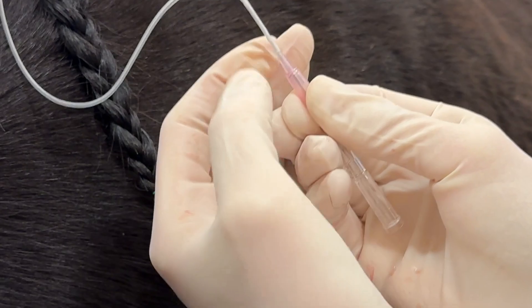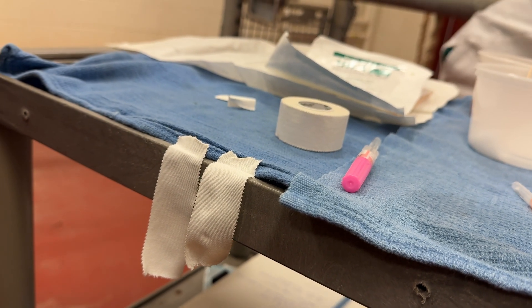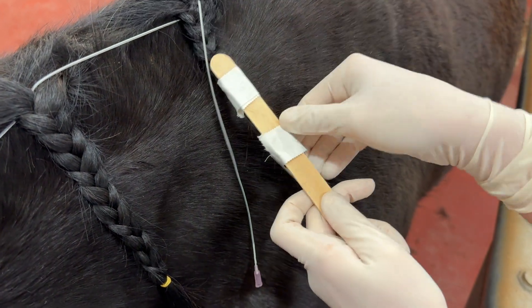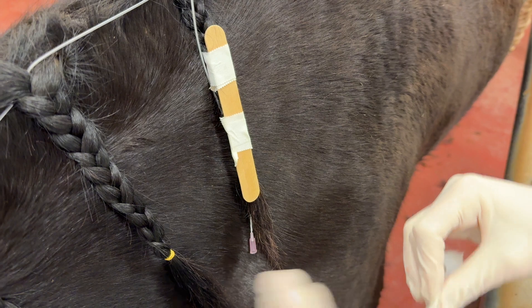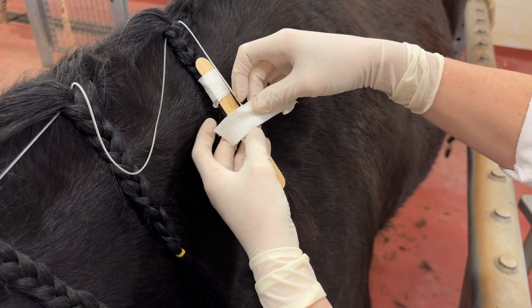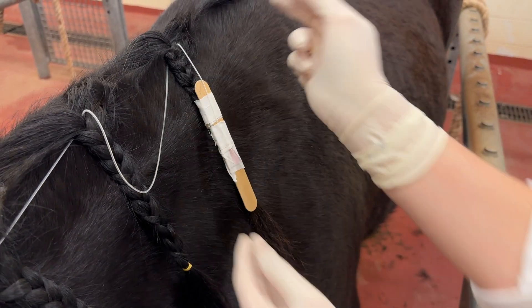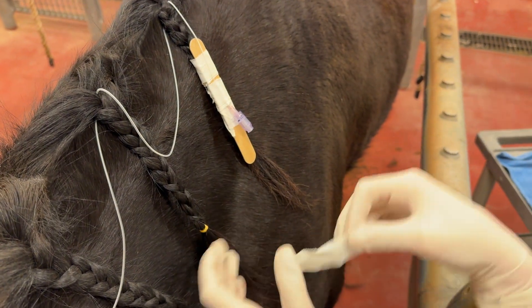There are many different ways to tape this onto the braid, but I recommend using small pieces of tape so that they can be replaced without having to unwind the whole thing, and leaving tabs in the areas that you need to potentially unravel later. Tape the actual catheter in place onto a popsicle stick so that you can have something to hold onto when administering medications. You can use an extension line from the catheter kit or put the injection cap directly onto the catheter. Make sure to tape the injection cap separately so that you can change it whenever it gets soiled, as well as every few days to keep it clean, since this is where you administer the medication.